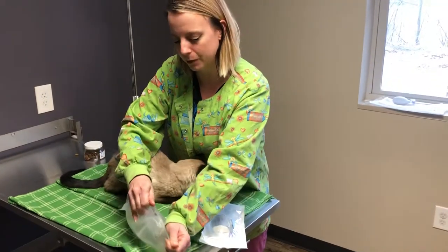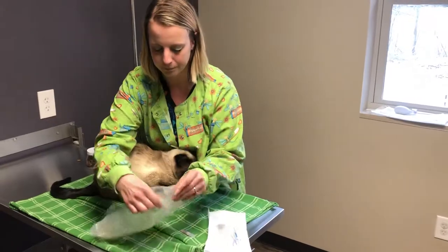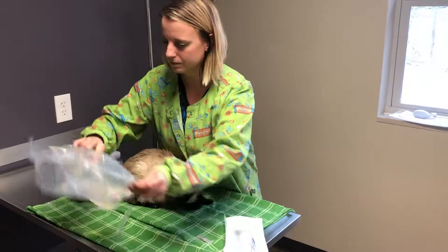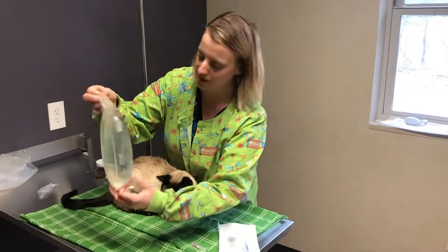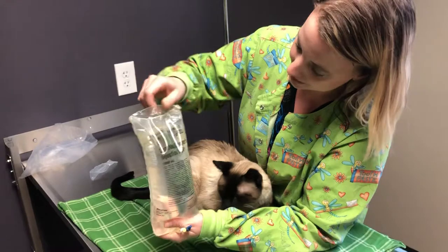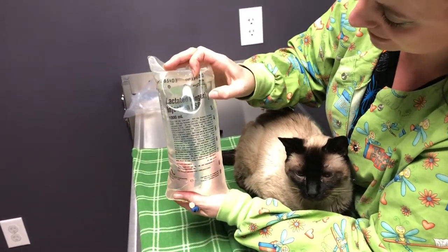There are different types of fluids so some are opened differently and the port might look a little bit different, so if you have any questions just call your doctor. This is a liter bag so it's a thousand mils of fluid. Depending on how much the veterinarian wants you to give your animal, you'll mark that down. Each line on the bag is a hundred mils, so Chico's going to get 200 and we're going to go down to this line right here.